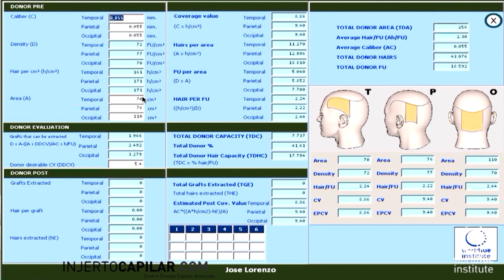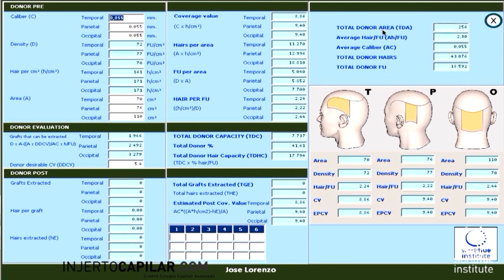We close the tab and go back to 'Donor,' and everything is filled out automatically by the application: information about density, hairs per square centimeter, coverage value, hairs per area, follicular units per area, hairs per follicular unit, the total donor area, average hairs per follicular unit, average caliber, total donor hairs, and total donor follicular units in the safe area.